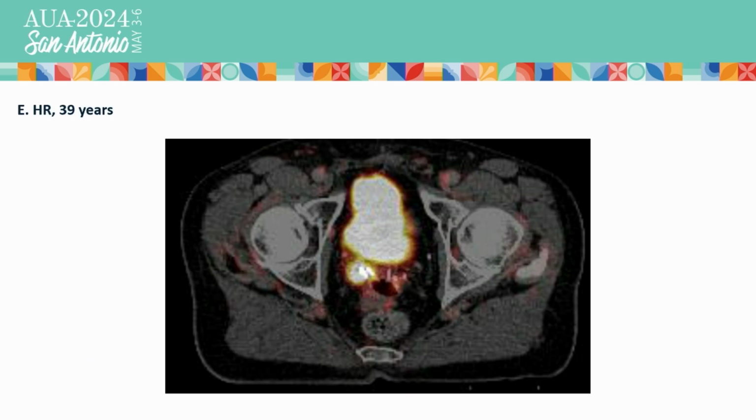What we detected in this situation is then a patient who had this type of relapse. What we were thinking, so you have the bladder here. You see all the clips here nicely after robotic-assisted radical prostatectomy. And then you have this type of locally recurrent disease. What could that be? Our nuclear medicine people are usually nice. They call it a PSMA lesion in the dorsolateral area of the bladder, because they don't want to blame the surgeon. It's a seminal vesicle remnant, which never should be there.